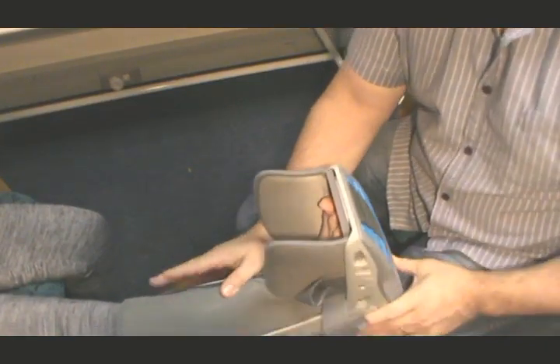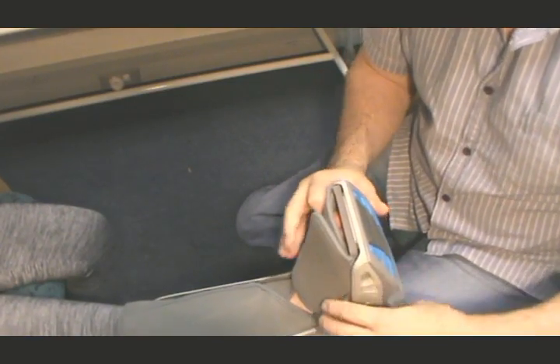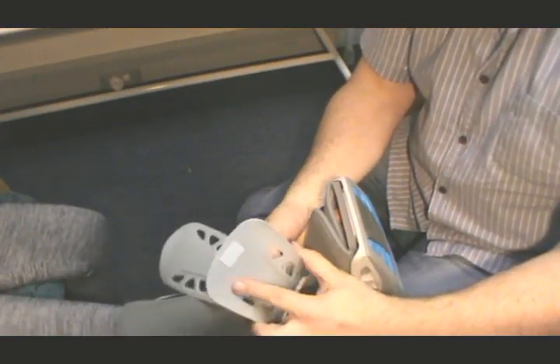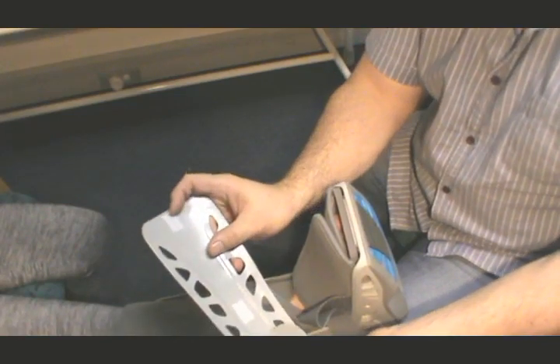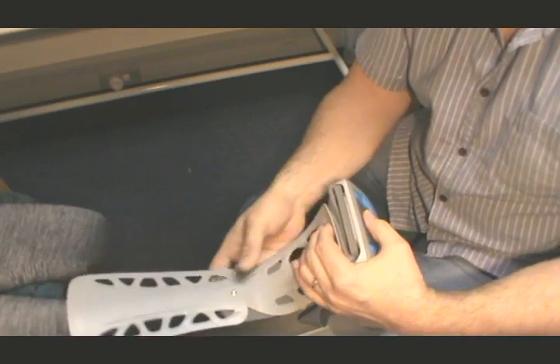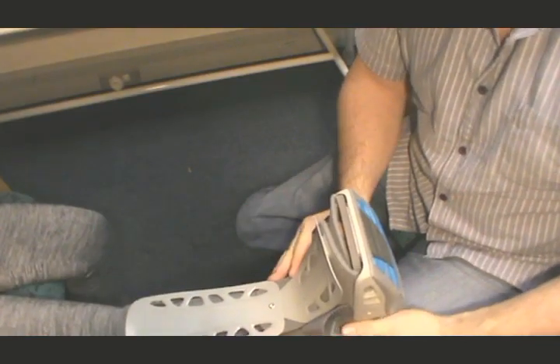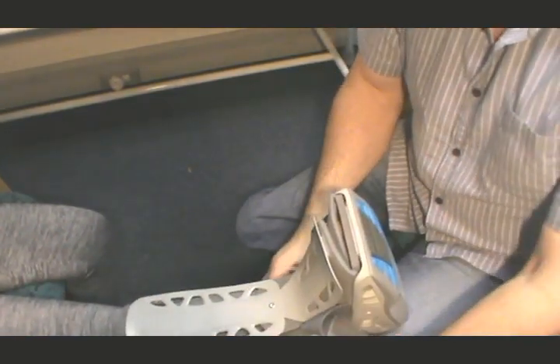So you've got the foam, first foam, and you've got your second foam there. And then you're going to put your front plate on. Your front plate has got a little piece of Velcro there and a little piece of Velcro there. So you're just going to pop that Velcro on there and push it down so that the top Velcro also sticks. So now you can see it's sticking and it's holding it in place without the straps yet.